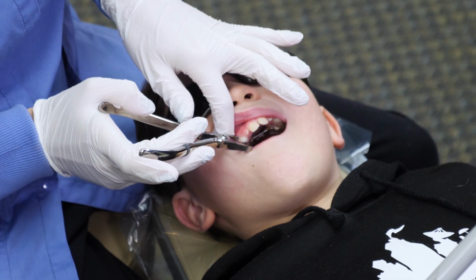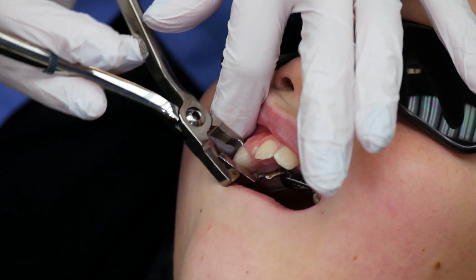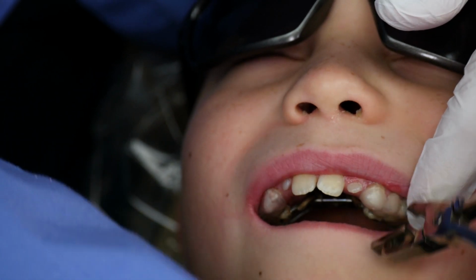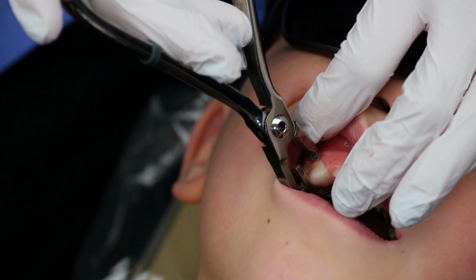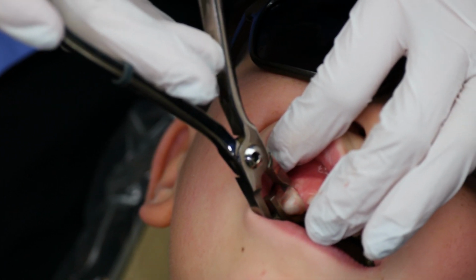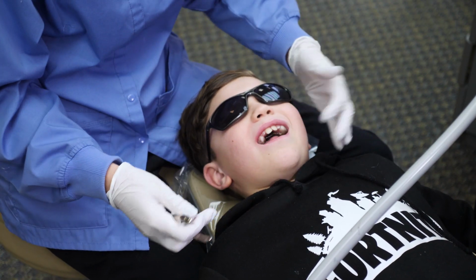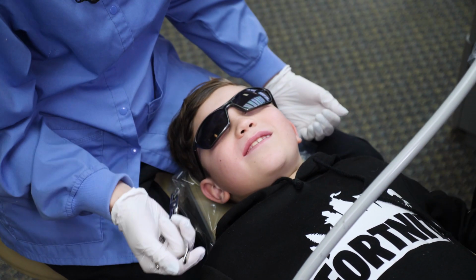Removal of an expander of this sort is comfortable for patients because the plastic that wraps the sides of the teeth has a flexibility that it's easily stretched, allowing air to get underneath the expander, and with a little jiggle from the side, the expander can be removed.